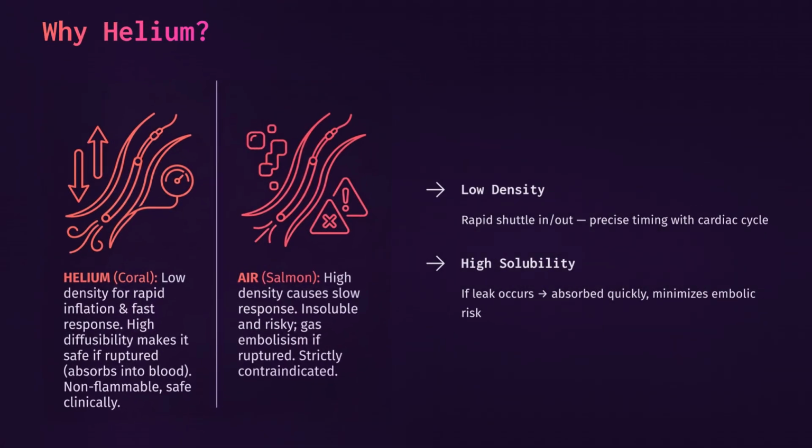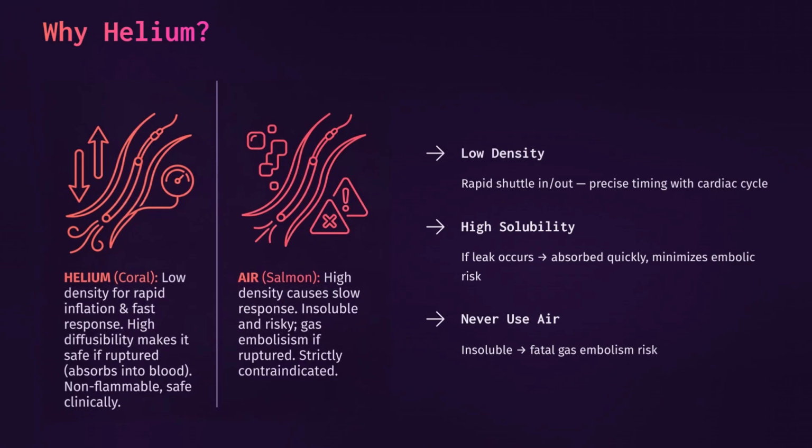Second, safety. Helium is highly soluble in the human body. It dissolves rapidly. If you pumped room air into the aorta and the balloon tore, you'd cause a massive lethal gas embolism. Helium dramatically reduces that risk.